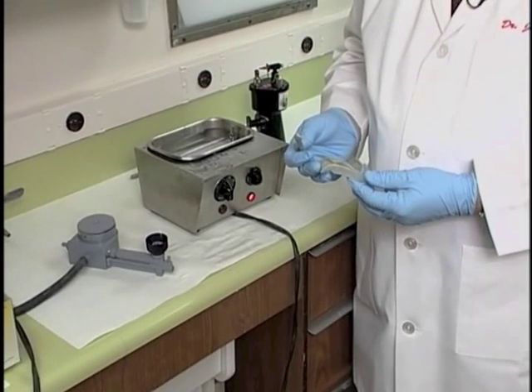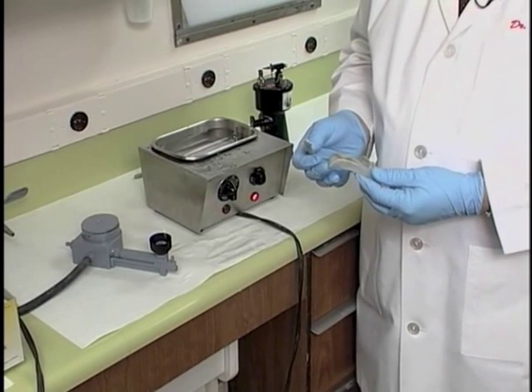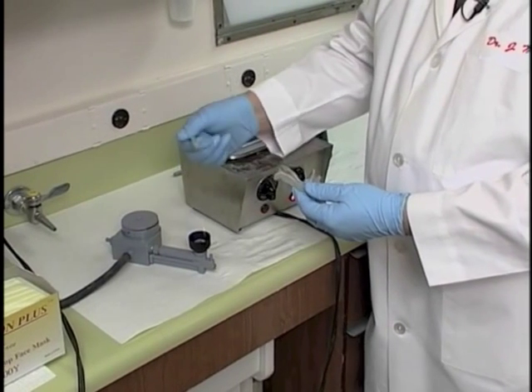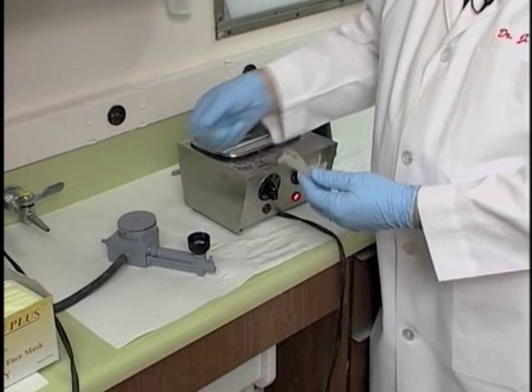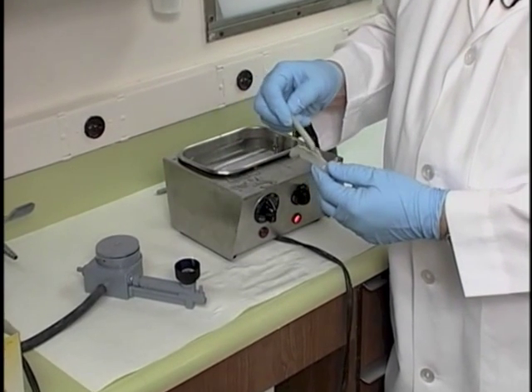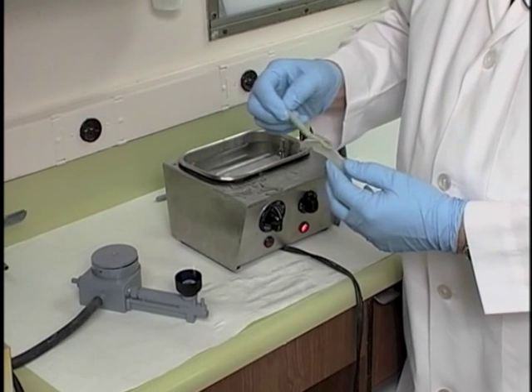The facial surfaces on the mandibular are identical to what we do on the maxillary, except we're doing it upside down. So we soften the compound in the flame, and we take it from about the second premolar area around to the retromolar pad.